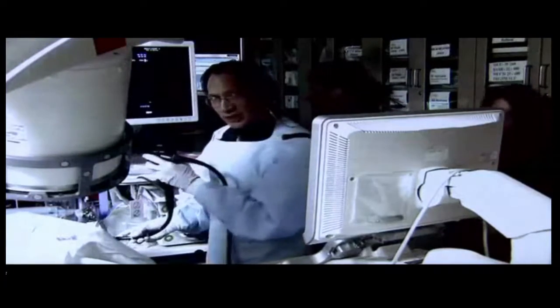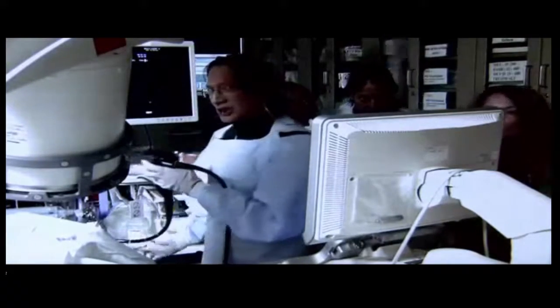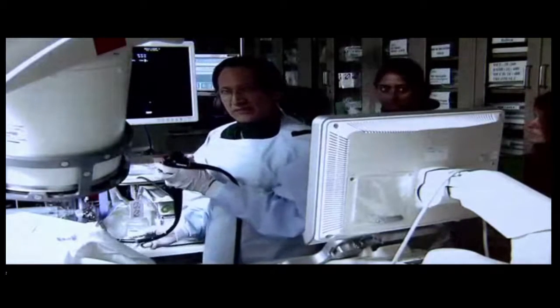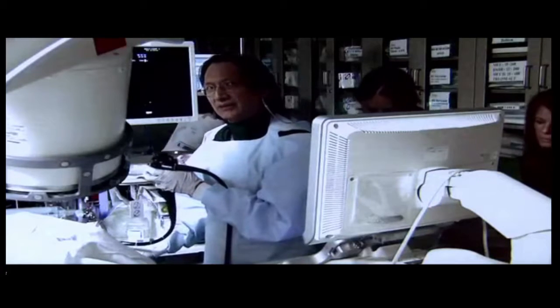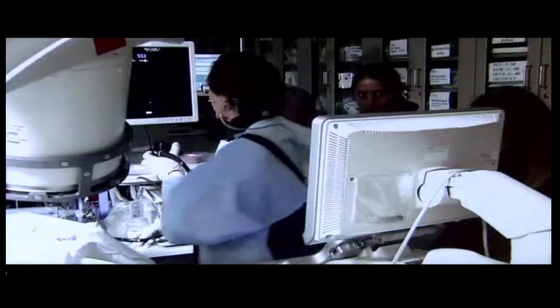The rendezvous procedure for divisum? For divisum, yeah. I've had a number of cases. I don't actually try too long trying to get in. When cannulation of the duct of Santorini is challenging, I'll go to rendezvous pretty quickly now. Wow. And I've been very successful with that. I think that's a great indication for the rendezvous.